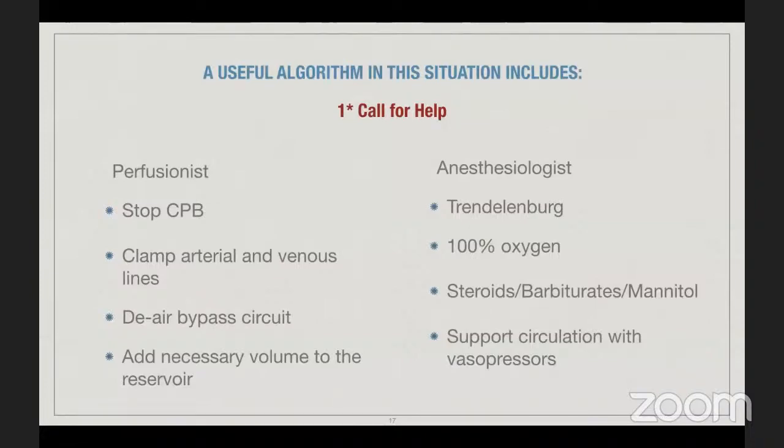Dr. Khaled explained how the vents work, right? It works through the roller pump. If the vent lines that are connected to the roller pump are connected to the opposite side, then when the roller pump rolls, instead of sucking the air, it will push the air to the patient. That's exactly what happened with that patient, and he had a massive stroke.